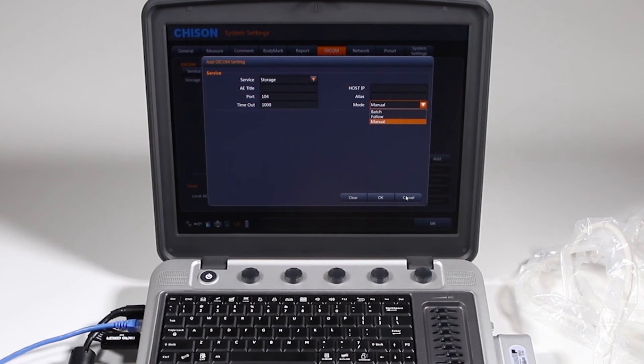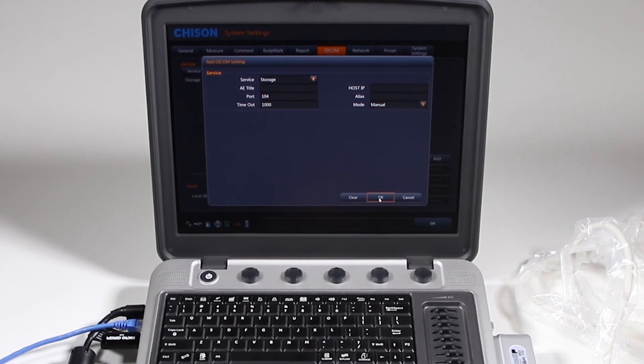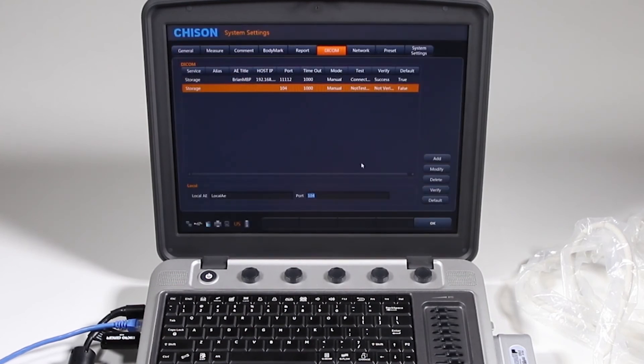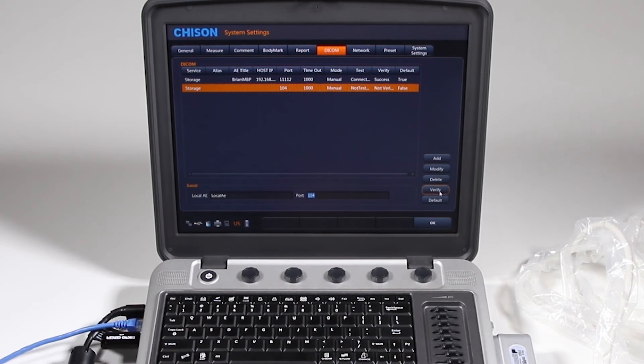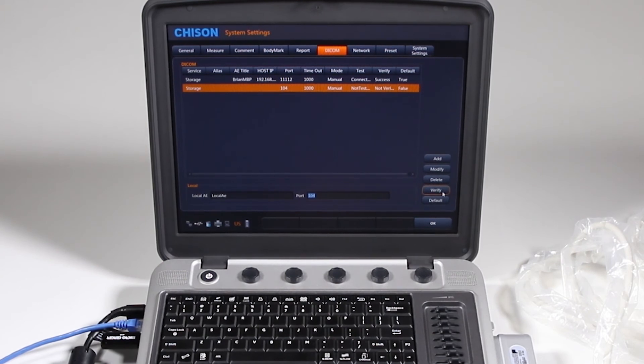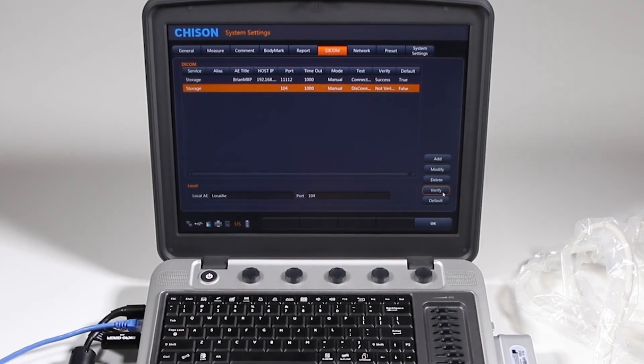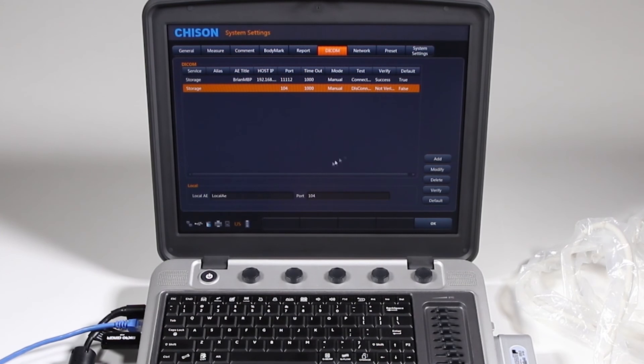Once you get that done, go ahead and click OK, and get back to this screen. So I have this new one set up that says not tested, not verified. You will not be able to work without verifying this. If it is not verified, it won't appear and won't let you do it.